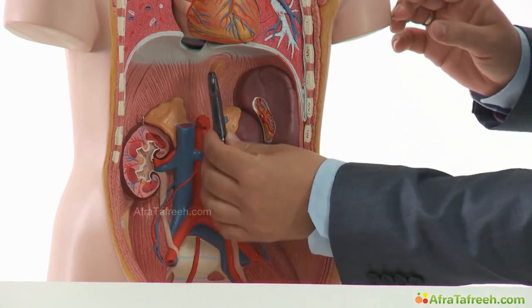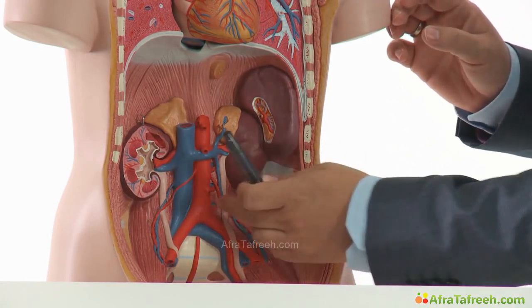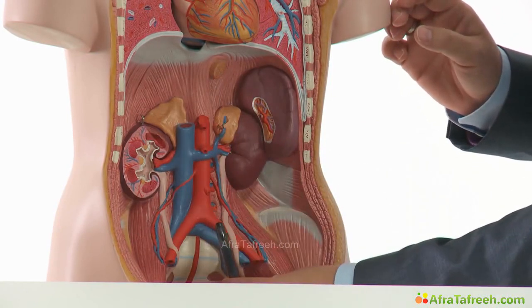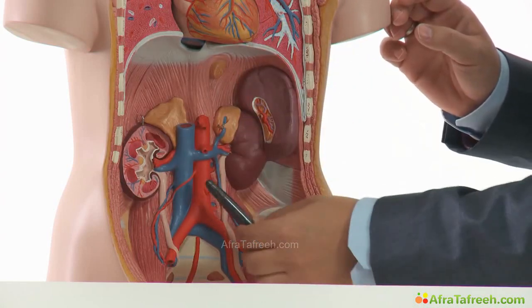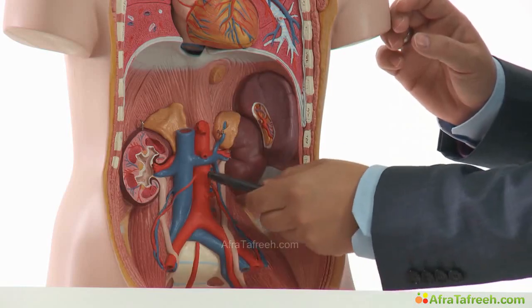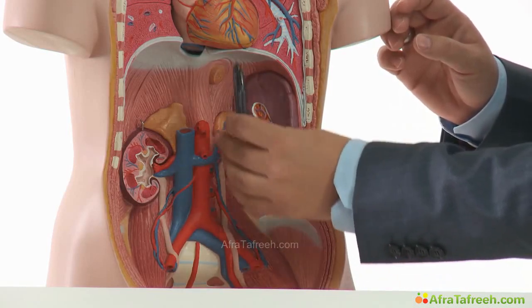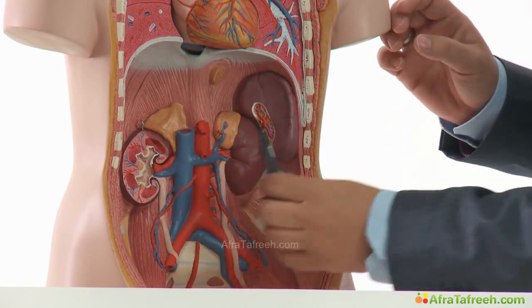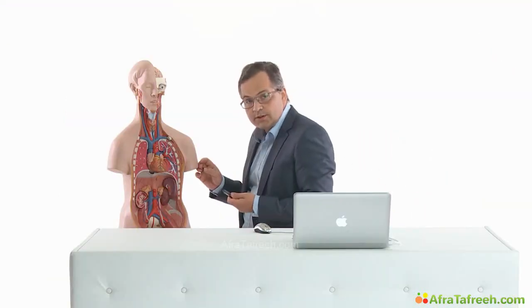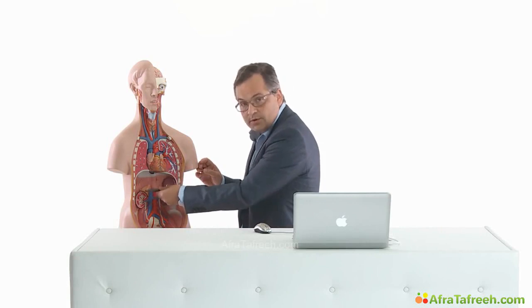The abdominal aorta is situated in the midline of the patient, anterior to the spine, and follows a strict vertical course from cranial to caudal. Slightly right from the midline, we find the IVC, also parallel to the aorta. When we start performing ultrasound, we place the probe in the longitudinal way in the midline of the patient and try to identify the aorta and the IVC. Then we follow its course caudally and display aorta and IVC, first in a longitudinal scan and afterwards in a transverse view.